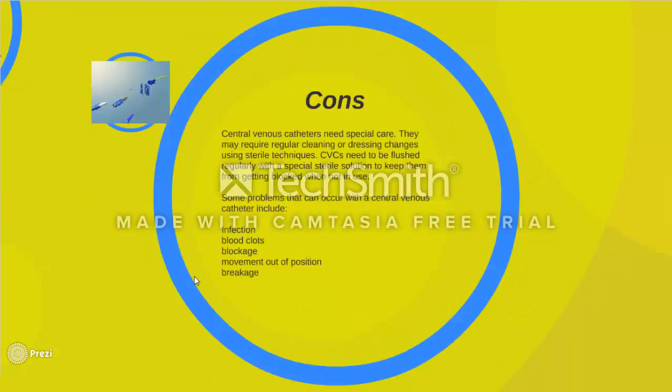Cons. Central venous catheters need special care. They may require regular cleaning or dressing changes using sterilized techniques. CVCs need to be flushed regularly with a special sterilized solution to keep them from getting blocked when not in use. Some problems that can occur with a central venous catheter include infection, blood clots, blockage, movement out of position, and breakage.